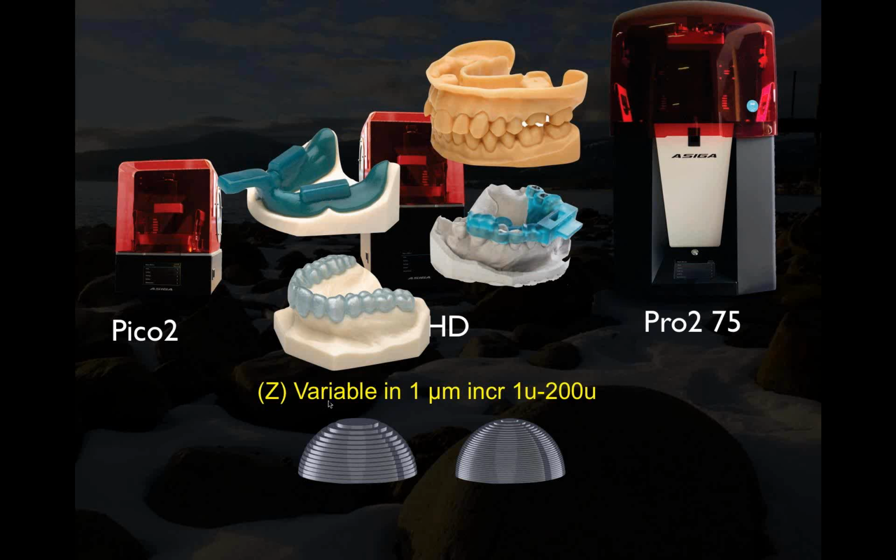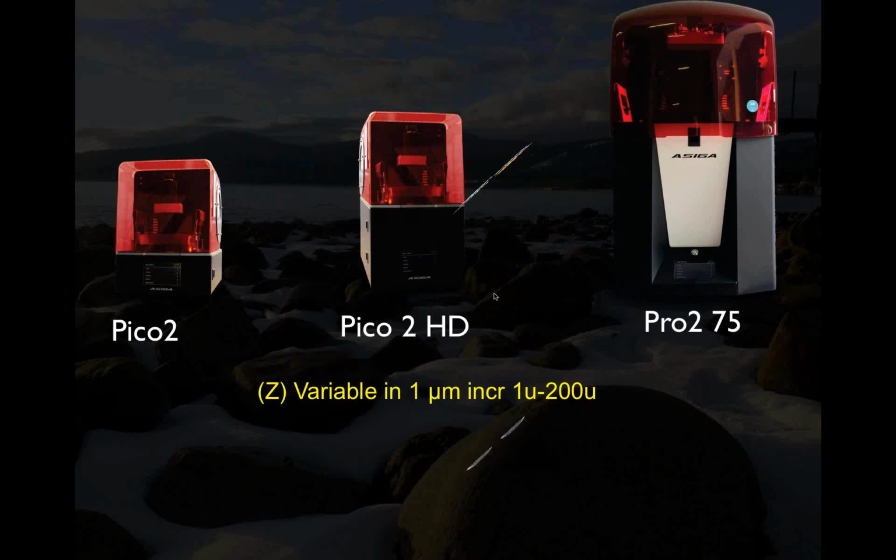These will print much faster, and they're perfectly good. That's what I love about these printers. I can just dial up the Z resolution to 100, and boom, print these twice as fast as from a 50 or 60 micron and have a perfectly acceptable result. Being able to do that is really important.